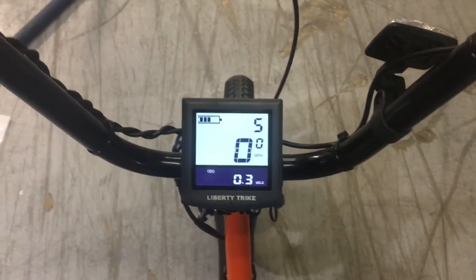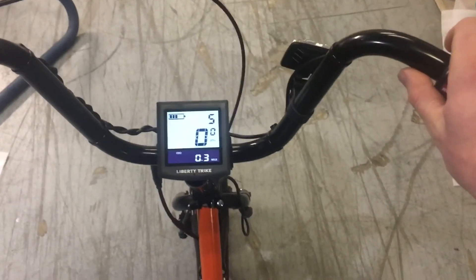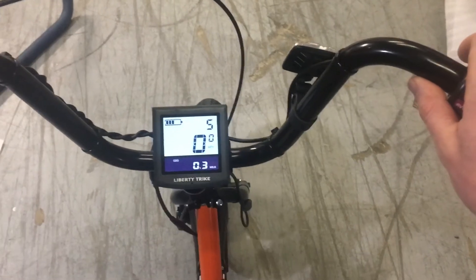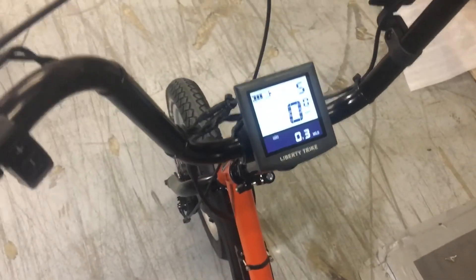As you're going forward with the handlebars in a nice neutral position and both hands on the bars, does it feel like everything is going straight forward when the handlebars are resting? It looks like we've got pretty straight handlebars relative to the front wheel now.